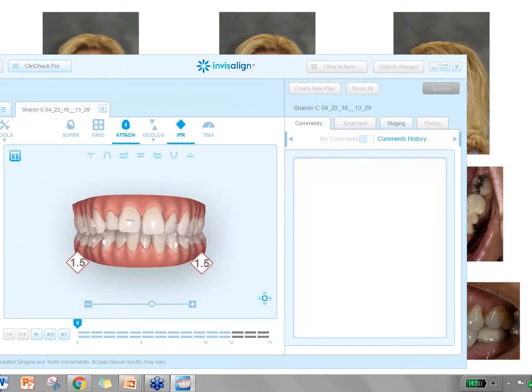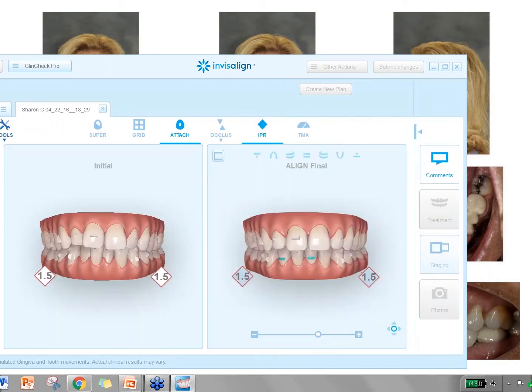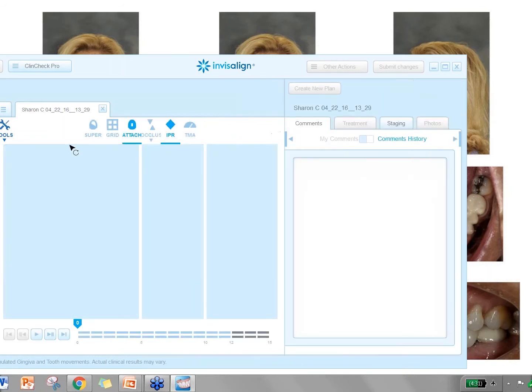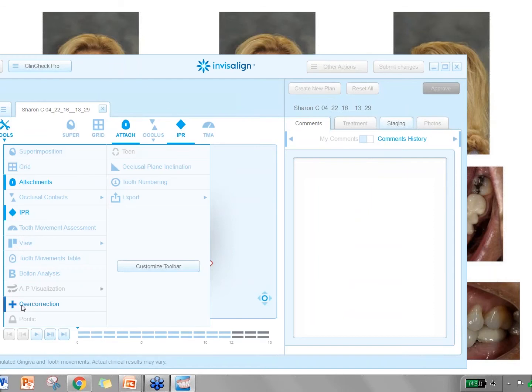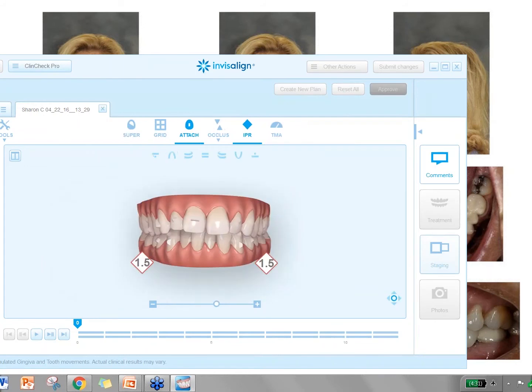Again, I didn't use those. We can turn those guys off. Oh, that's not what we wanted. Oh, there's just my initial and my final with one of the nice new software changes. But here we go, tools, turn off overcorrection. Now we can go ahead and play through this. We'll make it a little bit bigger for you.